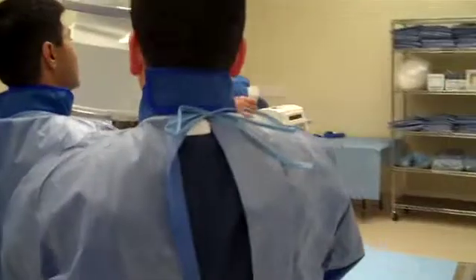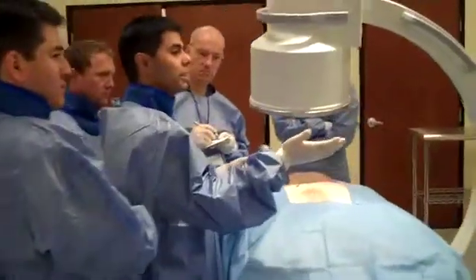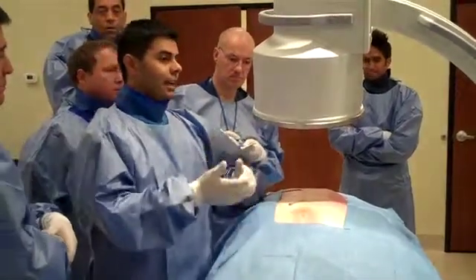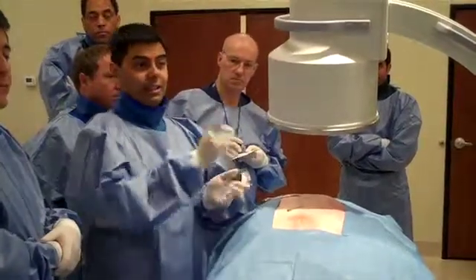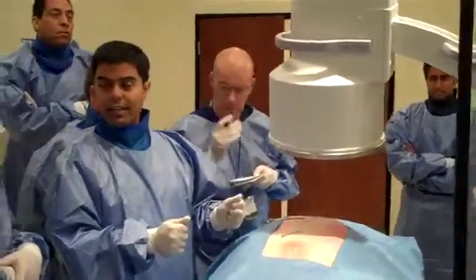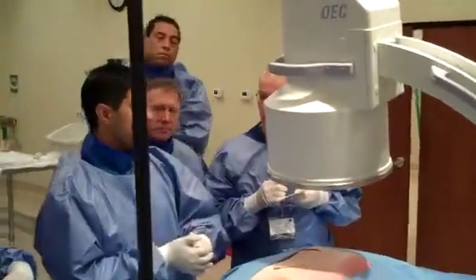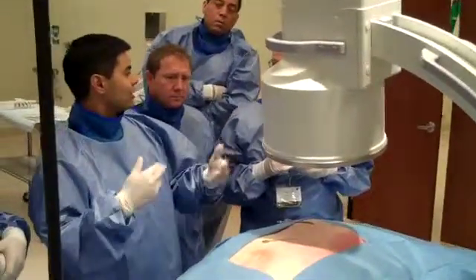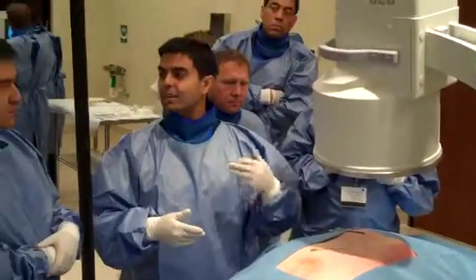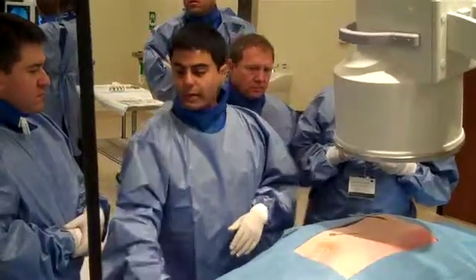Why T9 and not T11? Well, T11 is so close to T12 — I'll be able to see it if that was the case. And most of my placement ends up at the actual T8 region, whether it's T8 or T10 or T9 or T7, or at least it's in the actual field. The best thing about it also, which you'll notice, is whenever you get your images printed out from later on, you'll look at your image and be like, okay, the lead's at T7, the lead's at T8. You don't have to think about it, you don't have to question where your actual lead is. So if we're talking about reproducibility and actually getting back over there and reproducing the results again and again, the bottom line is that if we know where we are, that always helps out.